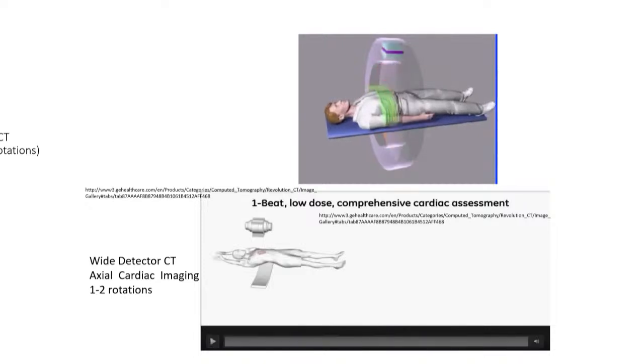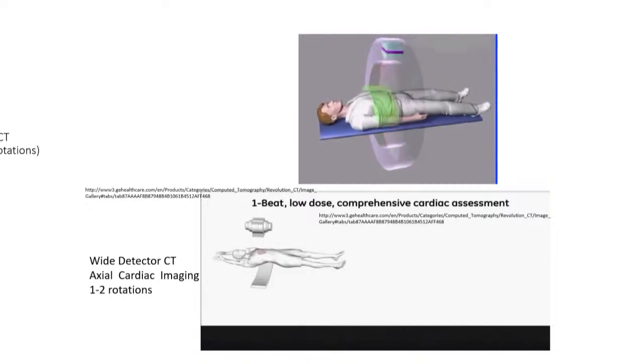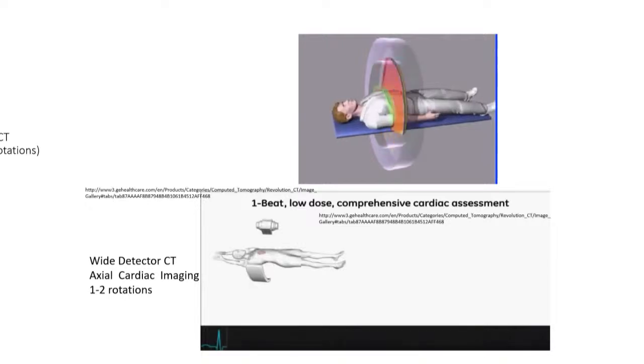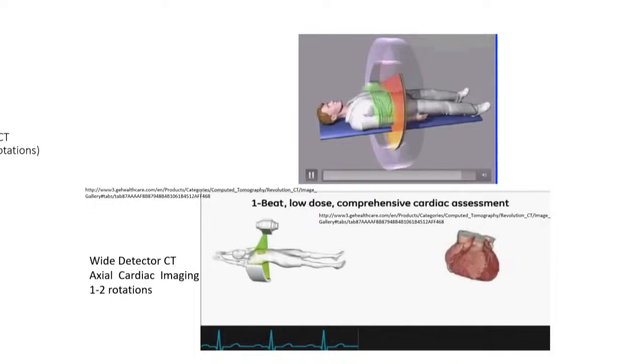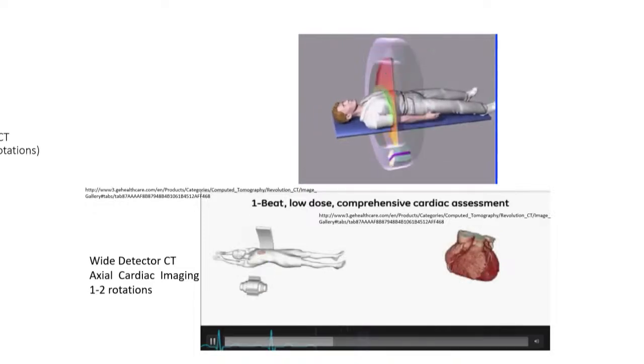Okay, so this is the difference between one single beat and several beats.